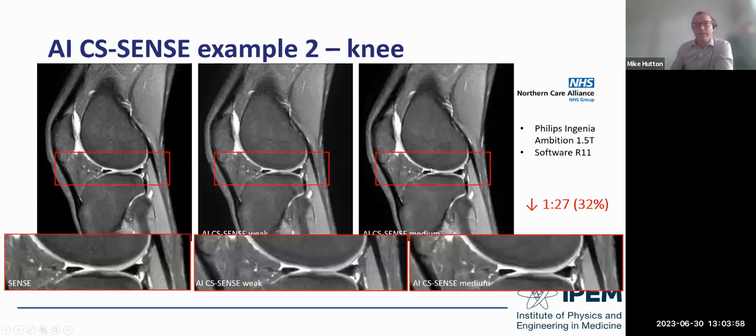And if we zoom in a little bit, we can see, I think, a bit more clearly that this has got quite a modified appearance compared to the original, whereas the weak denoising has less blurring, less smoothing of the noise, and maybe preferable for many radiologists. So we've got a good time saving there, and using weak denoising, we can almost match image appearance in general.